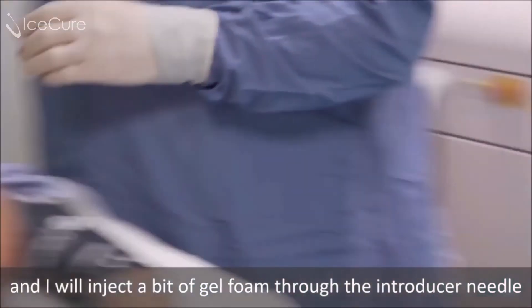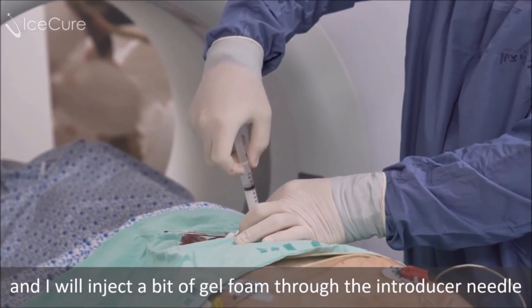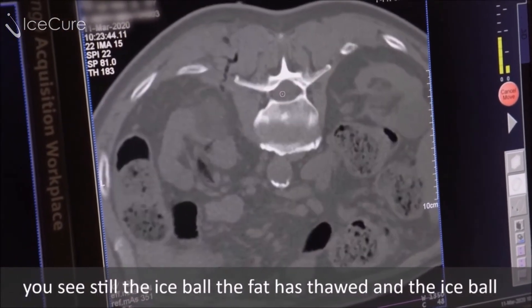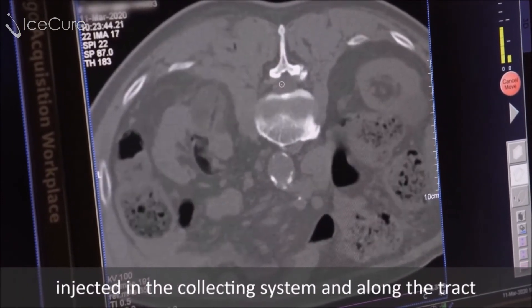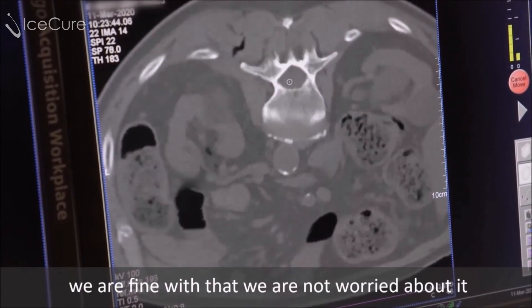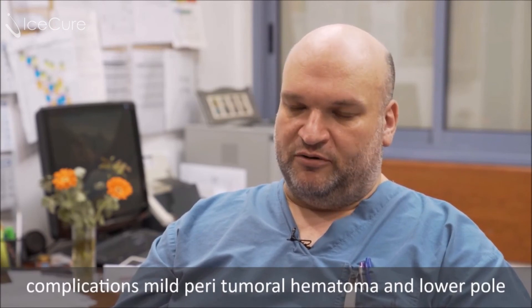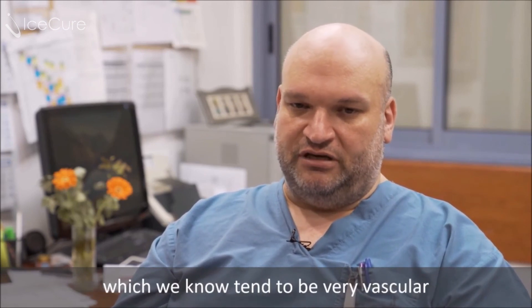I will inject a bit of gel foam through the introducer needle. This is the final scan after extracting the needle — we still see the ice ball. The fat has thawed and the ice ball remains; the tumor remains frozen. There's a bit of air from the gel foam injected in the collecting system and along the tract — we're not worried about it. The procedure went as expected without any unusual complications. Mild peritumoral hematoma in the lower pole lesion is expected after biopsy of kidney tumors, which we know tend to be very vascular.